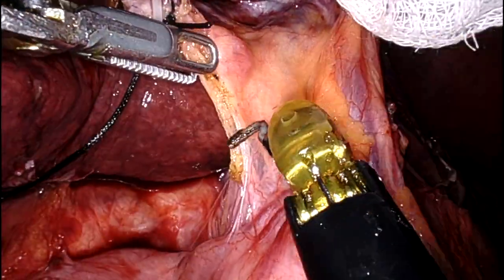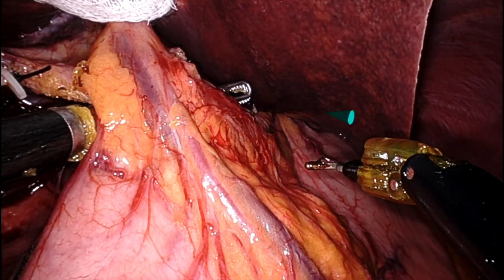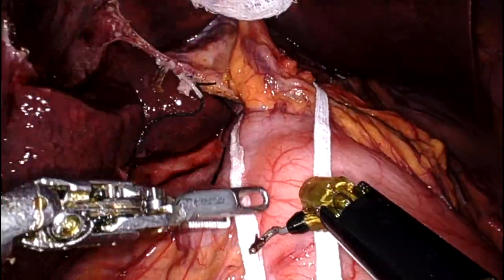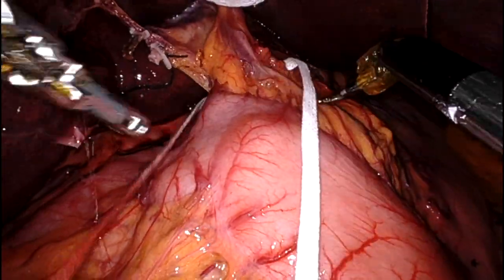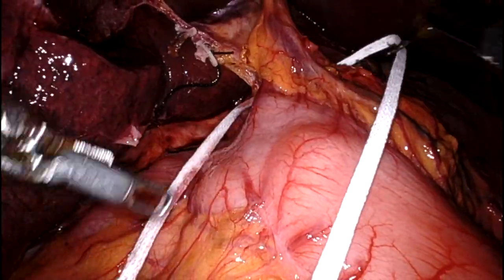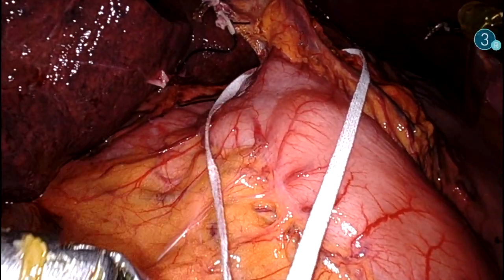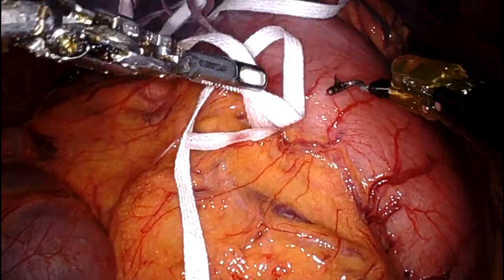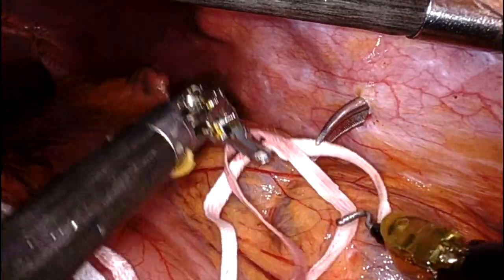Afterward I started the hilar dissection. Here I placed umbilical tape around the hilum for a Pringle maneuver. I'm still testing the best way to do a Pringle maneuver. Here I used a 20 French chest tube, which I exteriorized directly through the skin without using a port in the left upper quadrant — that worked really well. It retracted the hilum inferiorly onto the left side and was convenient for the assistant to do intermittent Pringle maneuver as needed.